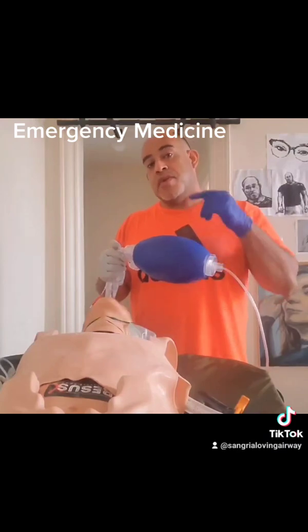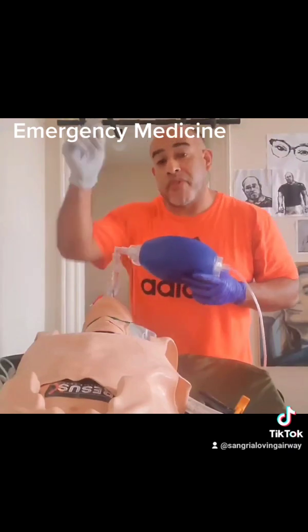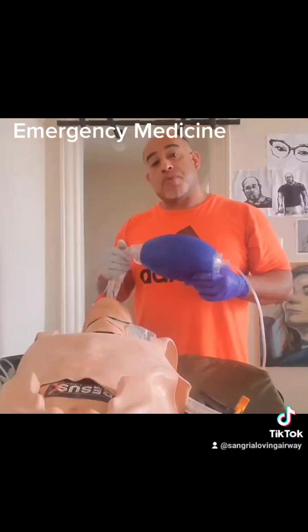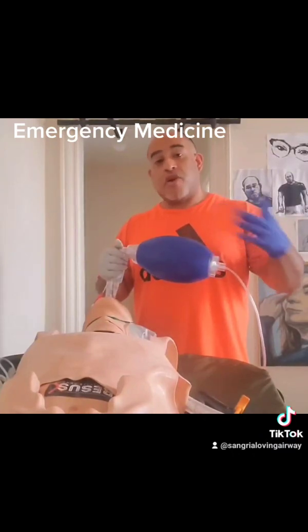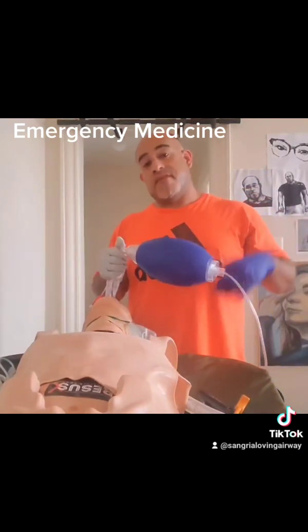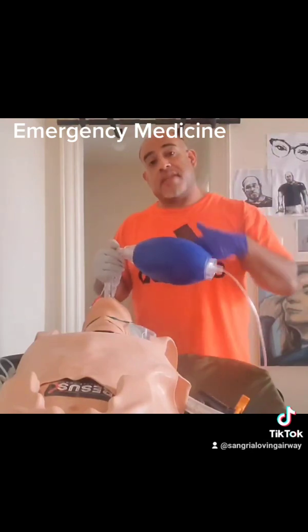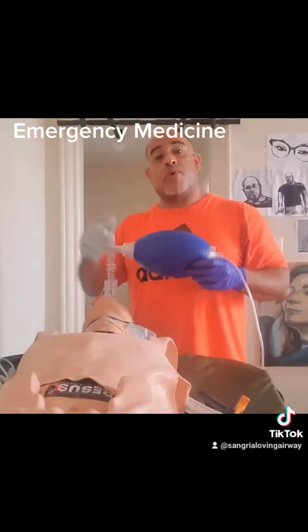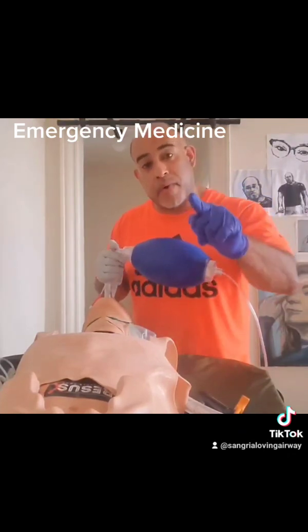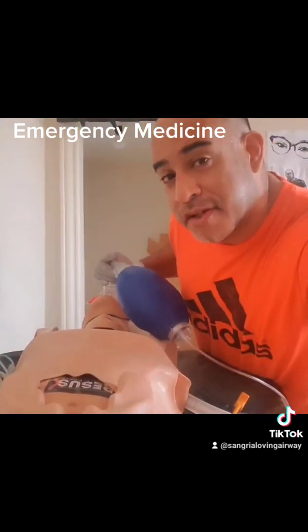You understand? You have enough issues going on instead of just focusing on airway. You're not just the airway guy. You're more than that. You're a resuscitationist. So again, start using your supraglottics way more often. During cardiac arrest is definite. You can actually use them in traumatic arrest. They'll tell you that's not definitive. Hey, there's no contraindication. Prove to me that you get the pulse back. Then replace it with a definitive airway with either a surgical airway or an oral intubation when you get the pulse back. Impress me that way. And then you try to impress me with your skills in airway then.